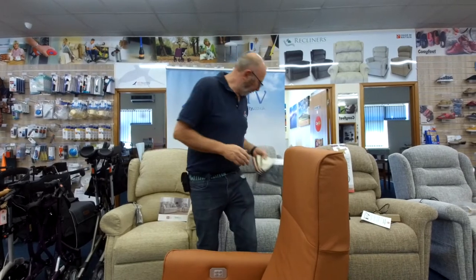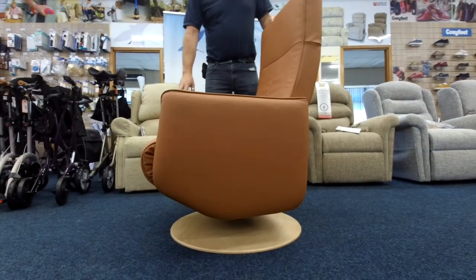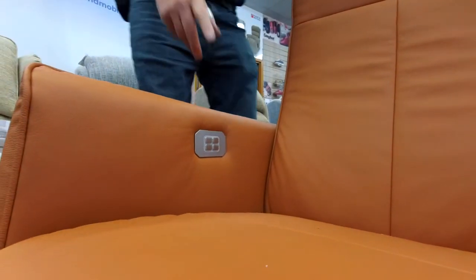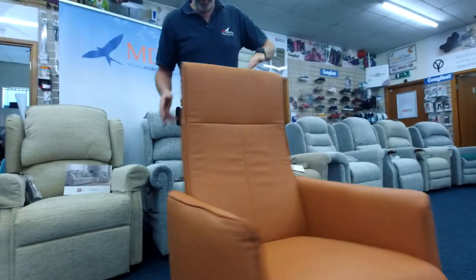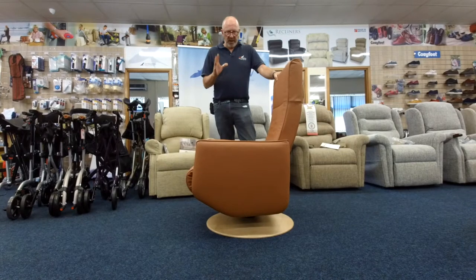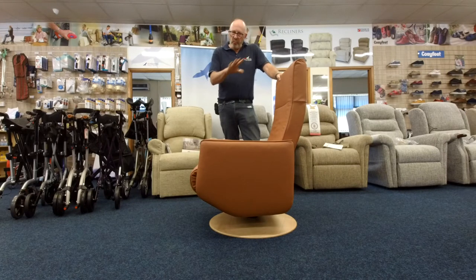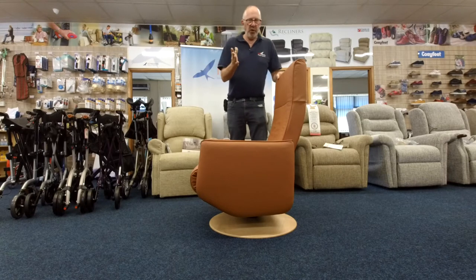Now, coming back to this chair — it's the Fitzroy, it's a swivel chair. With it being electric and a swivel chair, that creates a problem: where do you put the cable when it goes around 360 degrees? So what we've done is put a lithium battery inside it. For an average user, most of the time you can get away with charging it overnight once a week, because lithium batteries are excellent — they don't have a memory and they don't suddenly stop.